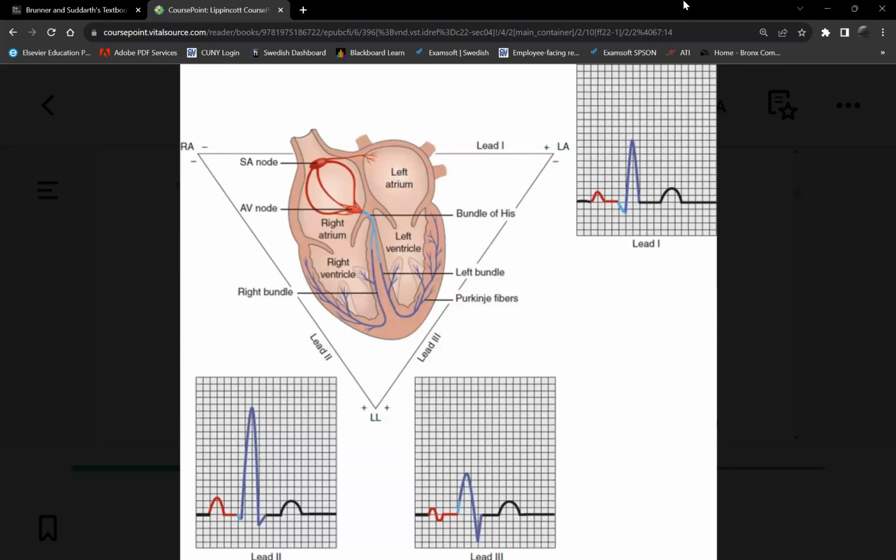So you have the heart there. Imagine you have somebody's head on top of that heart, and there are two lungs on each side. There's a right lung and a left lung. And over the corners where you see that upside down triangle, over those two top corners are the patient's shoulders. And then the patient's torso, of course, is where the heart is located. And then we've got the right leg and the left leg.